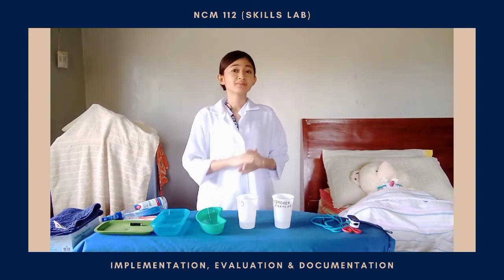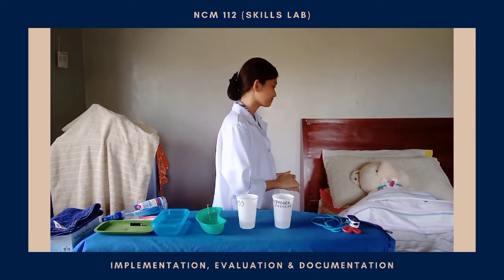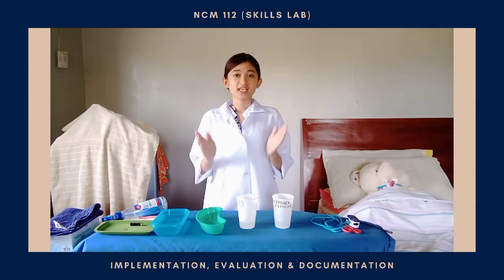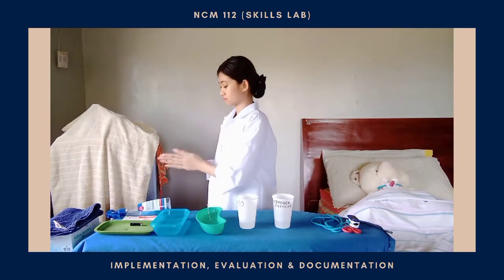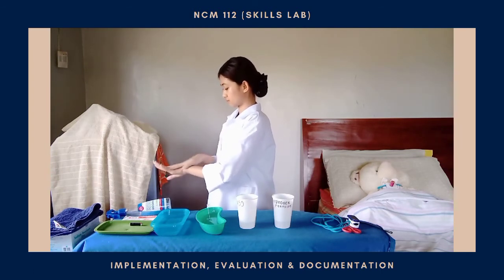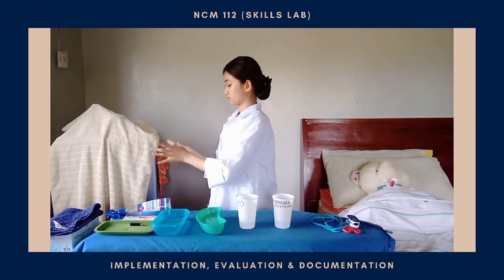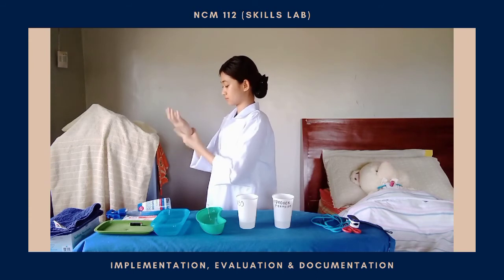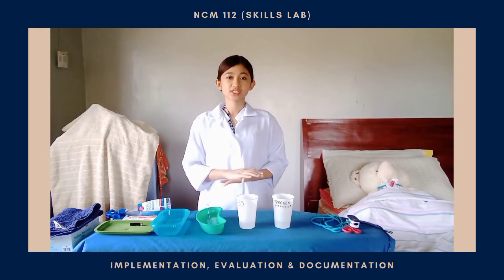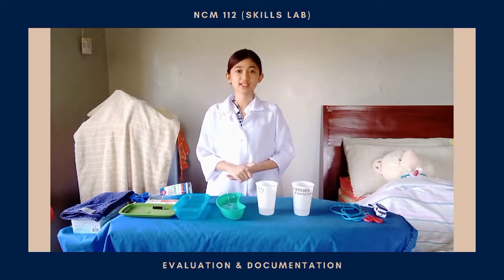Place the patient in a comfortable position, raise the bed rail and place the bed in the lowest position. Okay, ma'am, how are you feeling? Okay, that's good. Then, remove the additional PPE if used and perform hand hygiene. Proceed to document the procedures that you have done as well as the assessments that you have performed. Reassess the patient's respiratory status, including the respiratory rate, effort, oxygen saturation, and lung sounds.